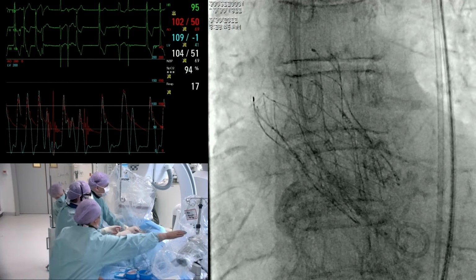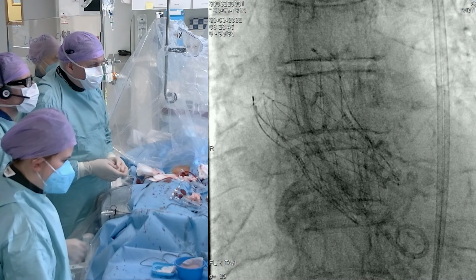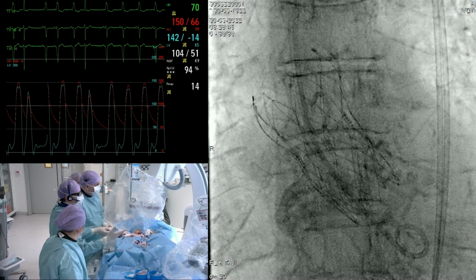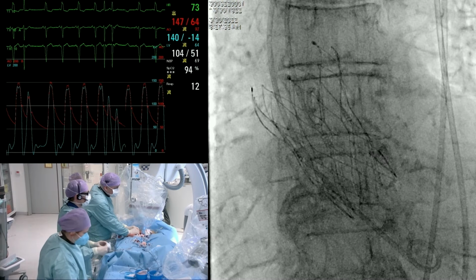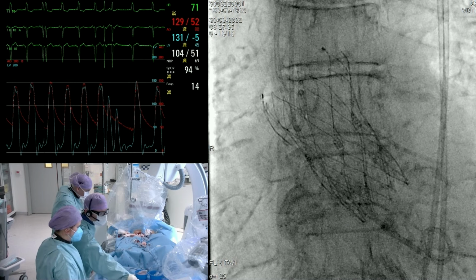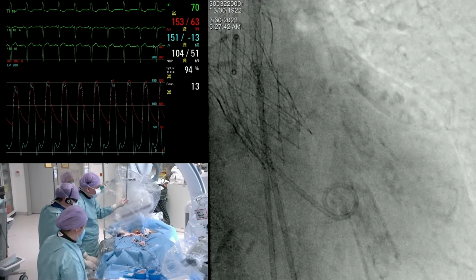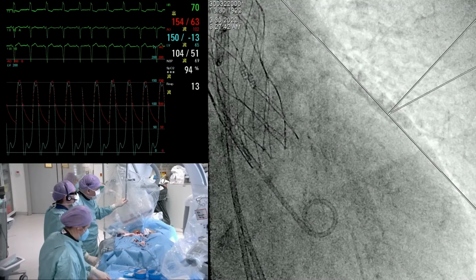Then we top part, like this. We're good again. So let's try to look at the hemodynamics. We had 64 before, we have 63, same. We had 24, we have 21. So we even have more diastolic separation because it was 40 millimeters mercury, now 42. So that certainly does not indicate any severe regurgitation. So we can do that final entry here in a cusp overlap, also to try to get rid of the descending aorta so we don't have any overlap between the LV and the aorta.